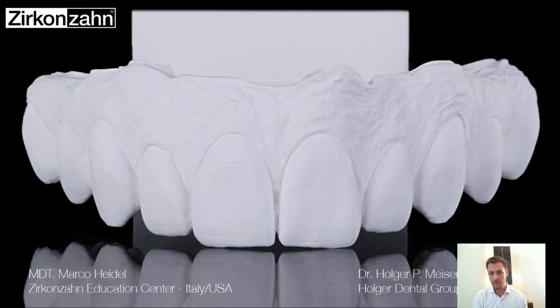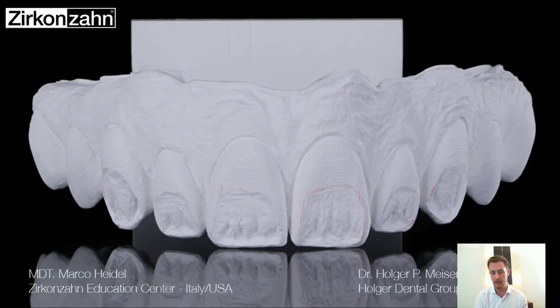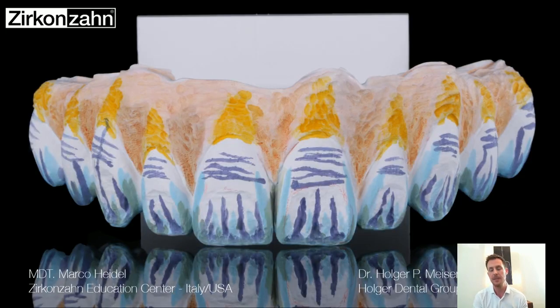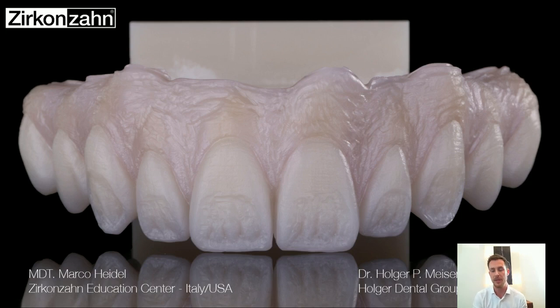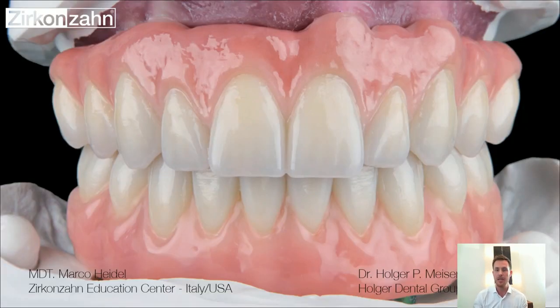In the upper jaw is a screw-retained zirconia bridge. Here I decided to also make a minimal labial cutback, yeah, as I showed you at the beginning, only 0.2, 0.3 reduction with mamelon structure in it. And that allows me then to make a small internal staining and to cover this area only with enamel or transfer masses of porcelain. Yeah? This is the situation after sintering, and this is the final product then, only to layer a little bit of enamel and porcelain for the gingiva area.